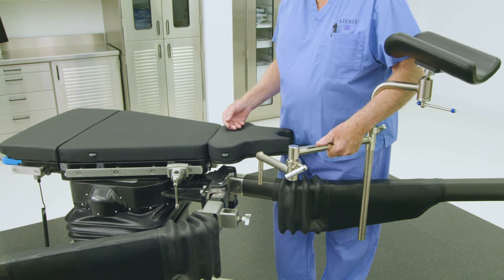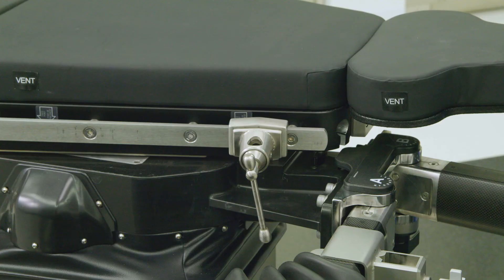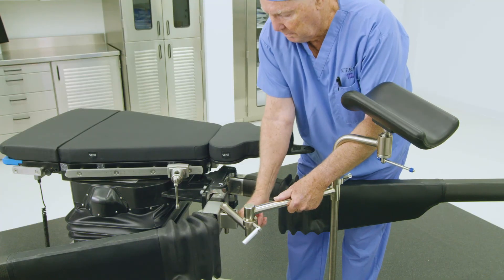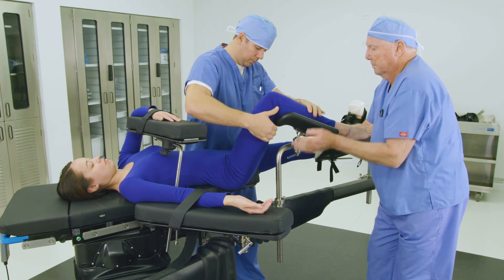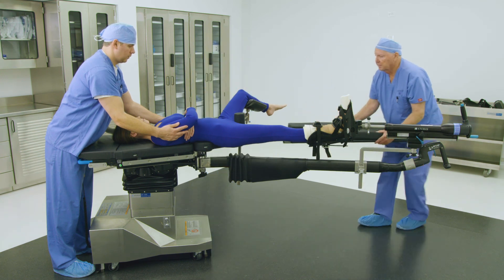Most unilateral orthopedic cases will employ the use of a universal leg holder to position the non-operative leg during surgery. A socket clamp for the side rail or a spar clamp can be used for accurate positioning. Place the socket clamp on the tabletop side rail on the non-operative side, or alternatively place the spar clamp on the short section of the spar on the non-operative side and tighten the handle to secure. Place the socket post into the socket clamp or spar clamp and tighten to secure. Use the adjustable joints of the articulating universal leg holder to position the device appropriately, ensuring all connections are secured before placing the patient's leg in the holder. Unlock the two knobs under the left and right side of the patient transfer board's prongs, remove the patient transfer board, and return it to storage.